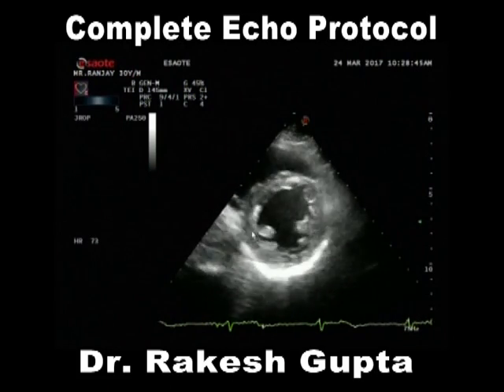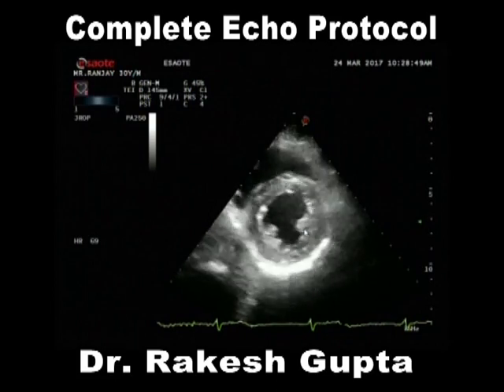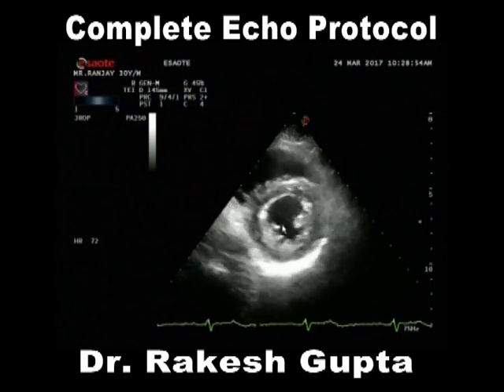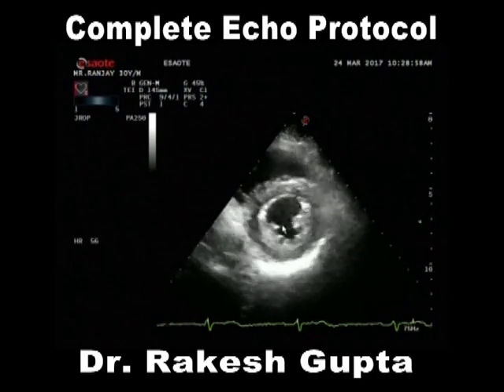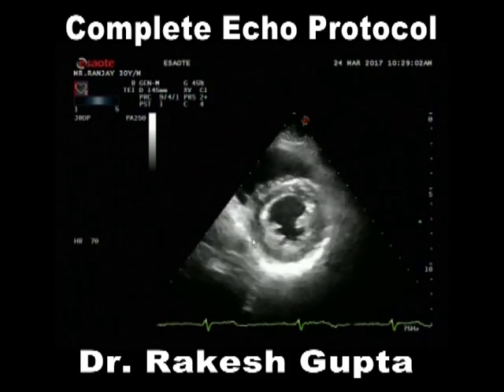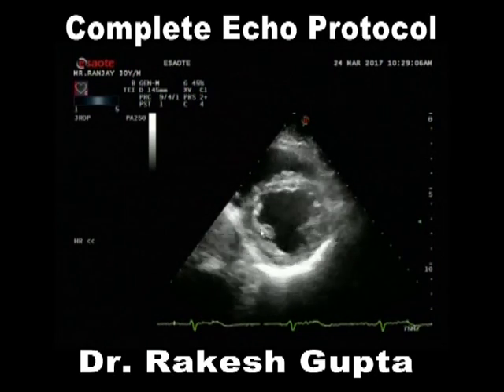If we go a little more towards the left hip, I am seeing both papillary muscles, one on this side, the other on this side. What I said in the beginning is, if you are looking at mitral stenosis in a 4-year-old or 5-year-old child, you have to look for both papillary muscles. If one of them is absent, obviously this is a parachute mitral valve.